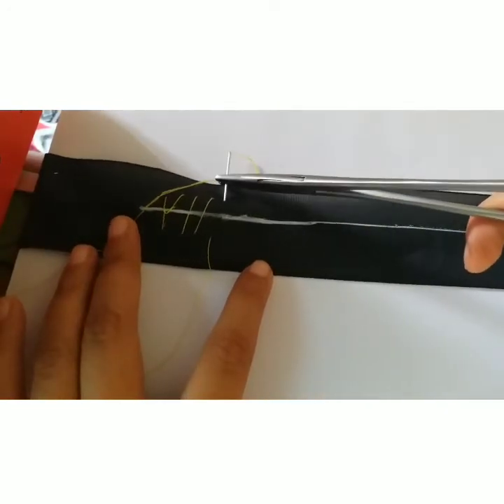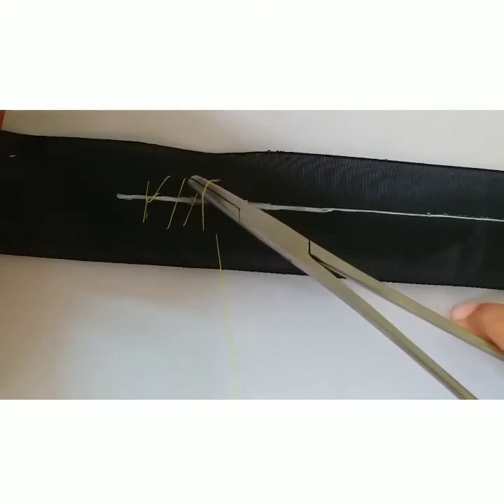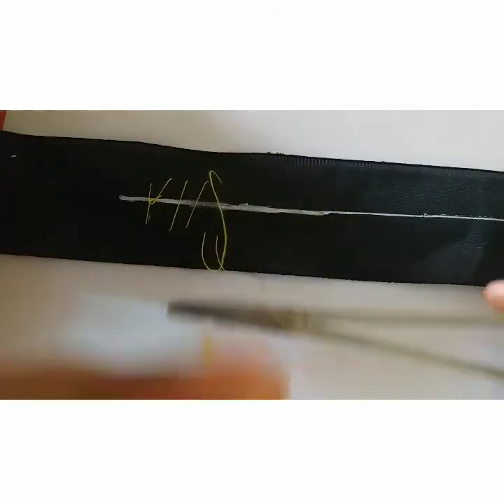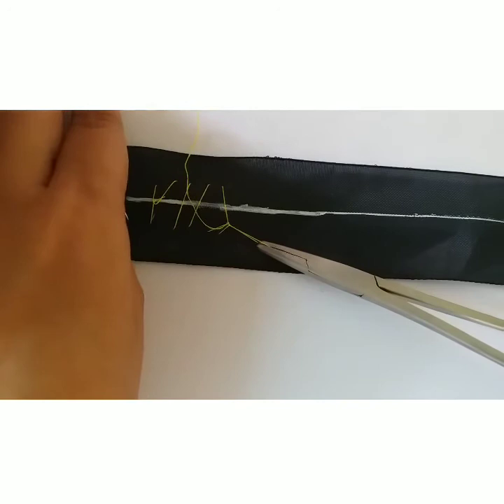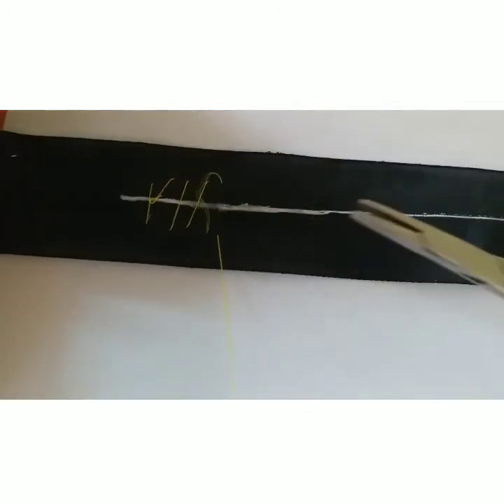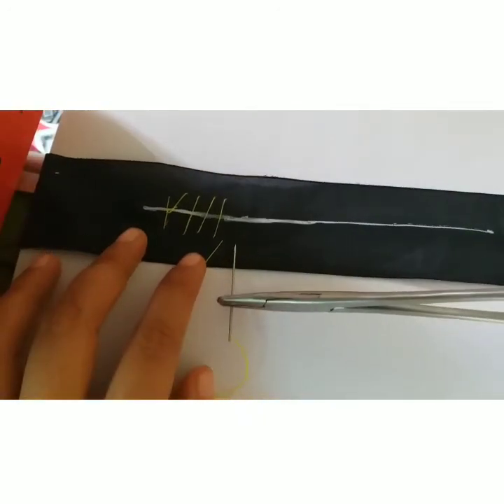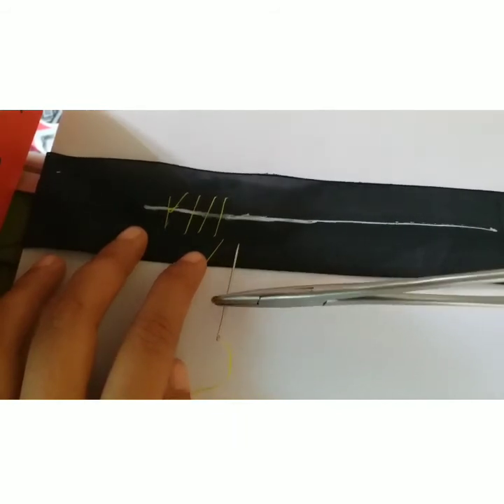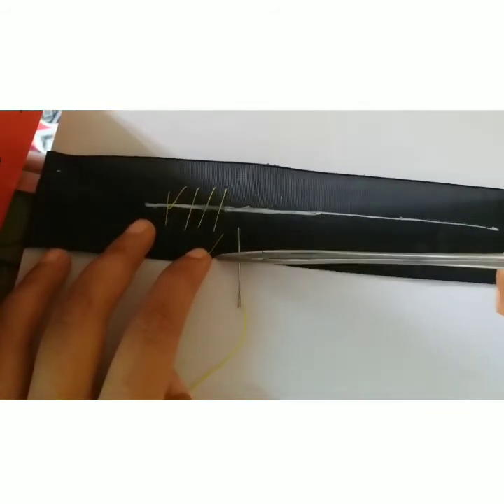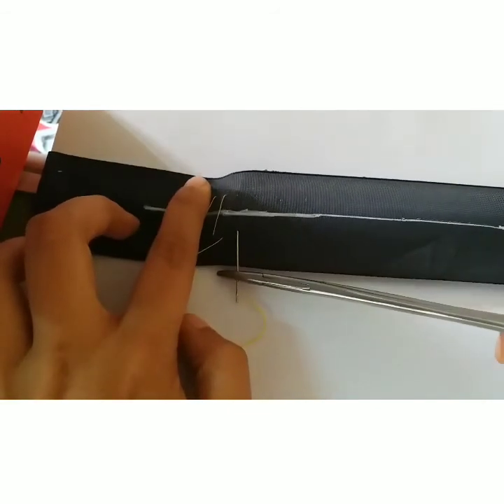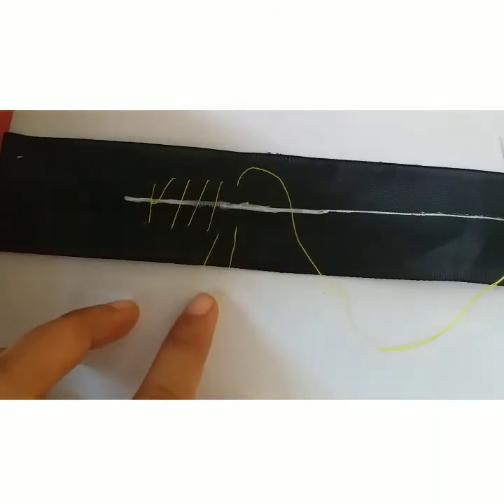Now we have two methods to end the pattern using the previous suture's loop. It is also fine. We can go for a backhand. We adjust the needle so it should be perpendicular to the forceps, and we go across the incision. And then we can tie it in the loop.